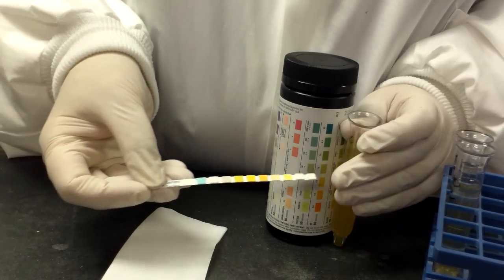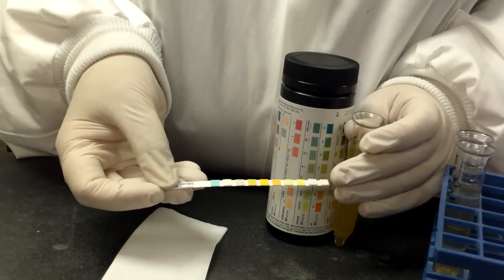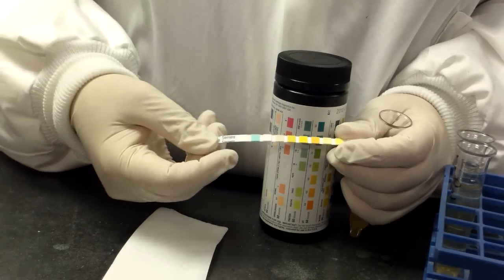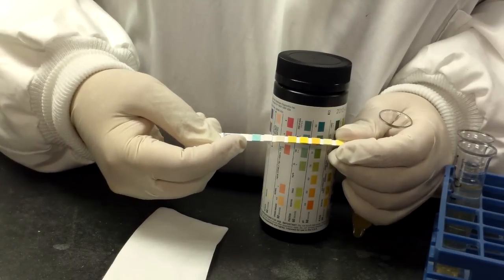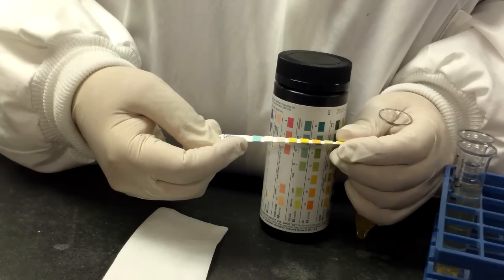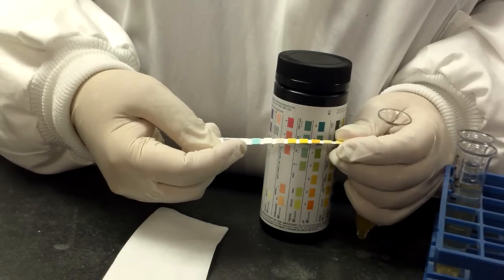When you put it in, you want to make sure you get all of the squares damp. And on this particular one, there is a small white square right here that is used by the analyzer for color comparison. We're going to ignore that in the manual count.